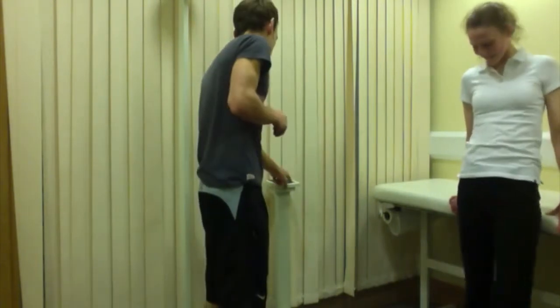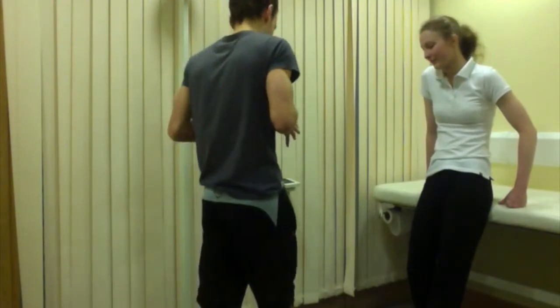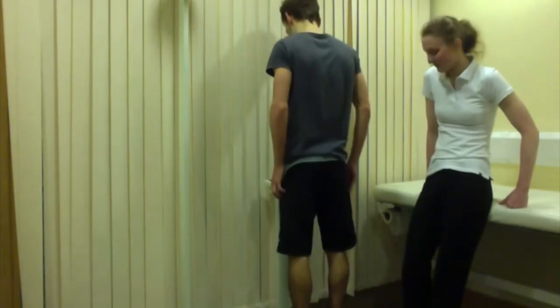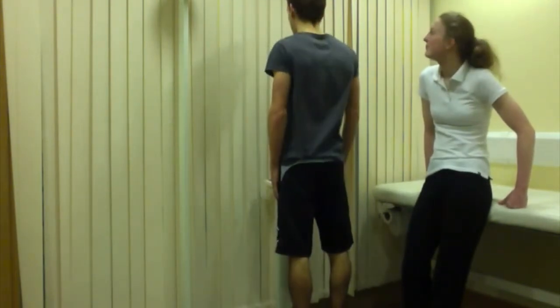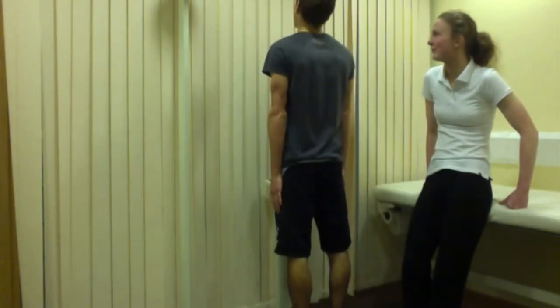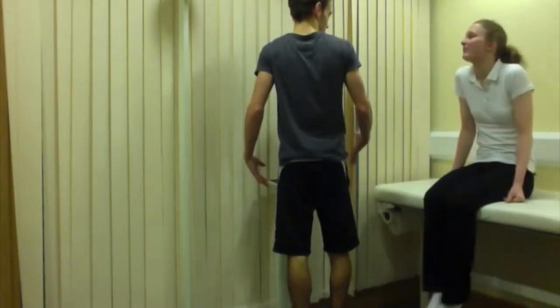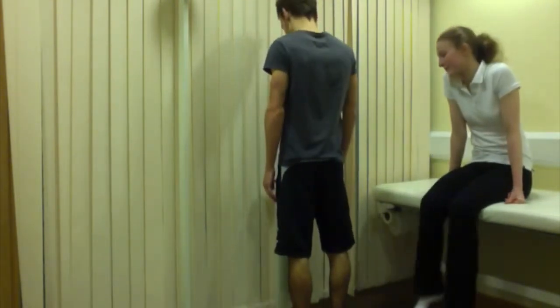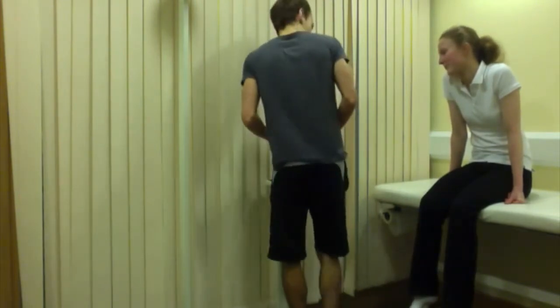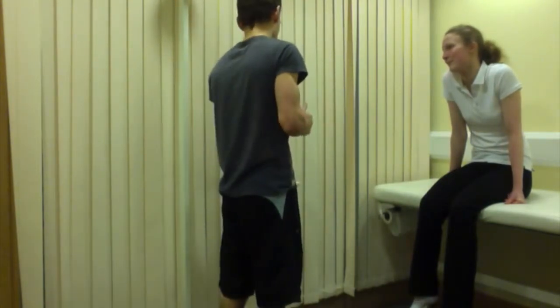We're going to start again because the scale goes off automatically. You're going to step on, put your feet about hip-width apart so your weight spreads evenly, and look straight forward — not bringing the head down or up. Keep your posture and head straight, otherwise it can alter your weight by changing the force of gravity. I'll record your weight once it's steady.